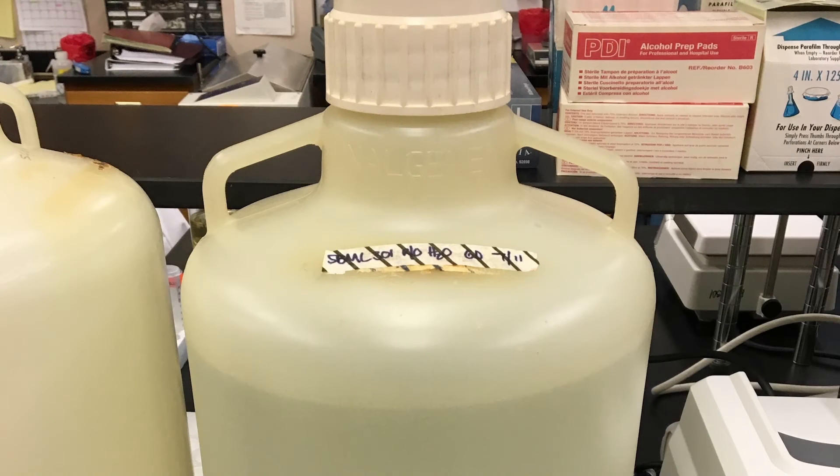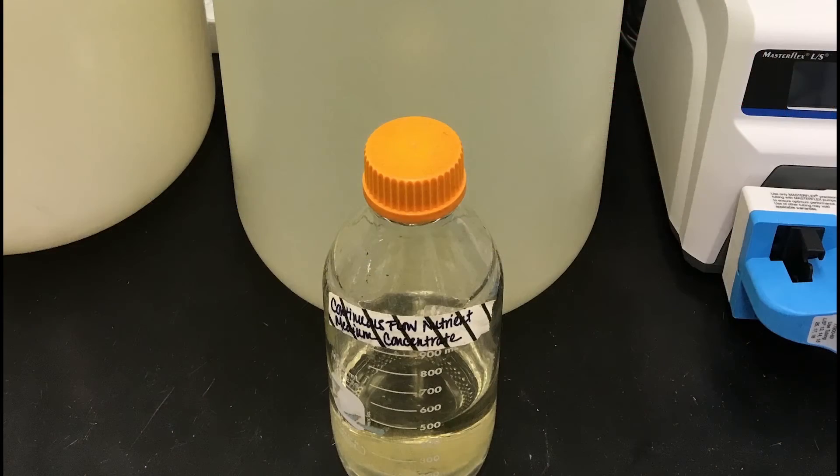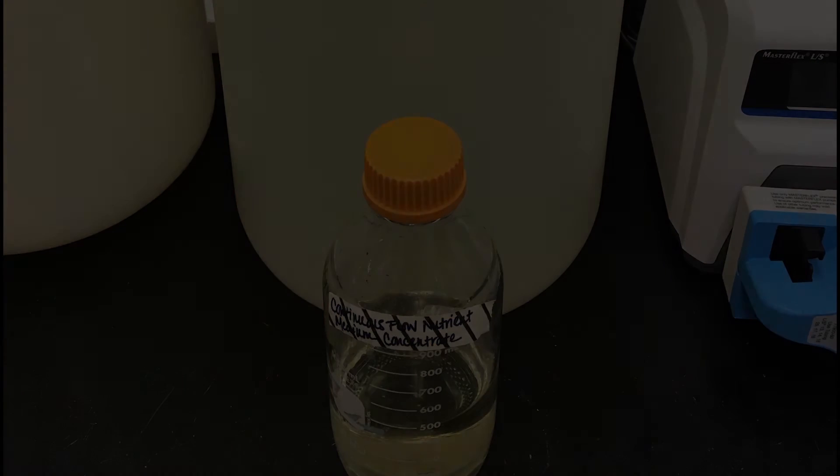Sterilize a 20-liter carboy of reagent grade water. Note the actual volume in the carboy after autoclaving. To prevent caramelization, a nutrient medium concentrate of TSB is prepared separately.